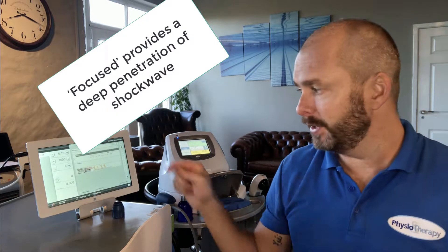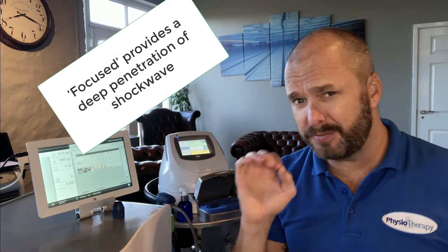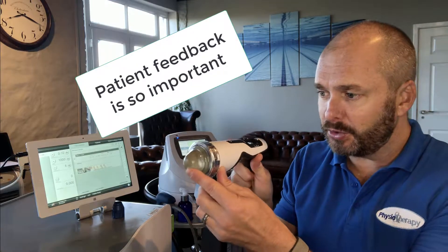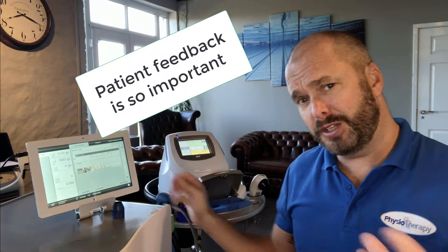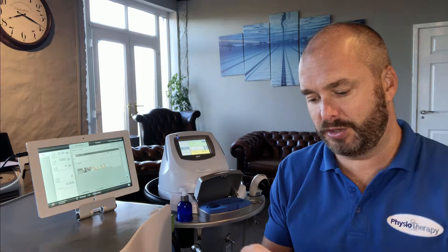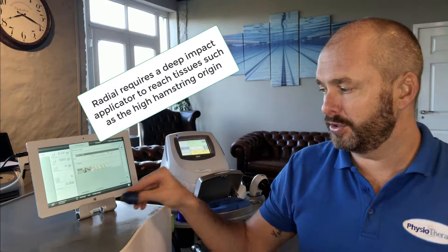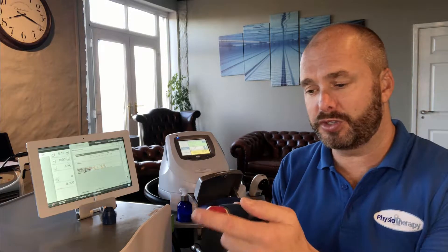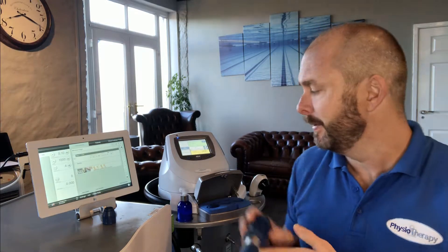If you were trying to treat a high hamstring origin with the focused machine, you'd be able to be very specific about where that treatment went, but you'd have to rely on patient feedback all the time to make sure you were angling it in the correct position. With the radial, you'd also be looking at that same high hamstring issue, using the gold head because you need greater depth, and you'd need to really push it into the tissue to reach the high hamstring.